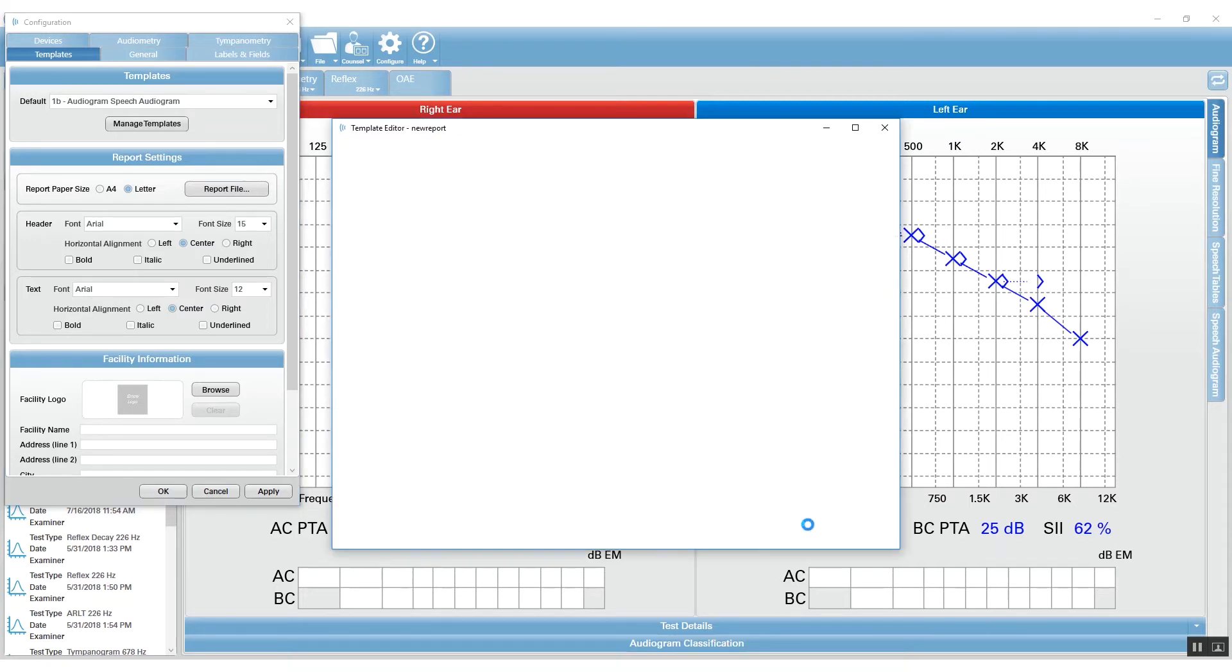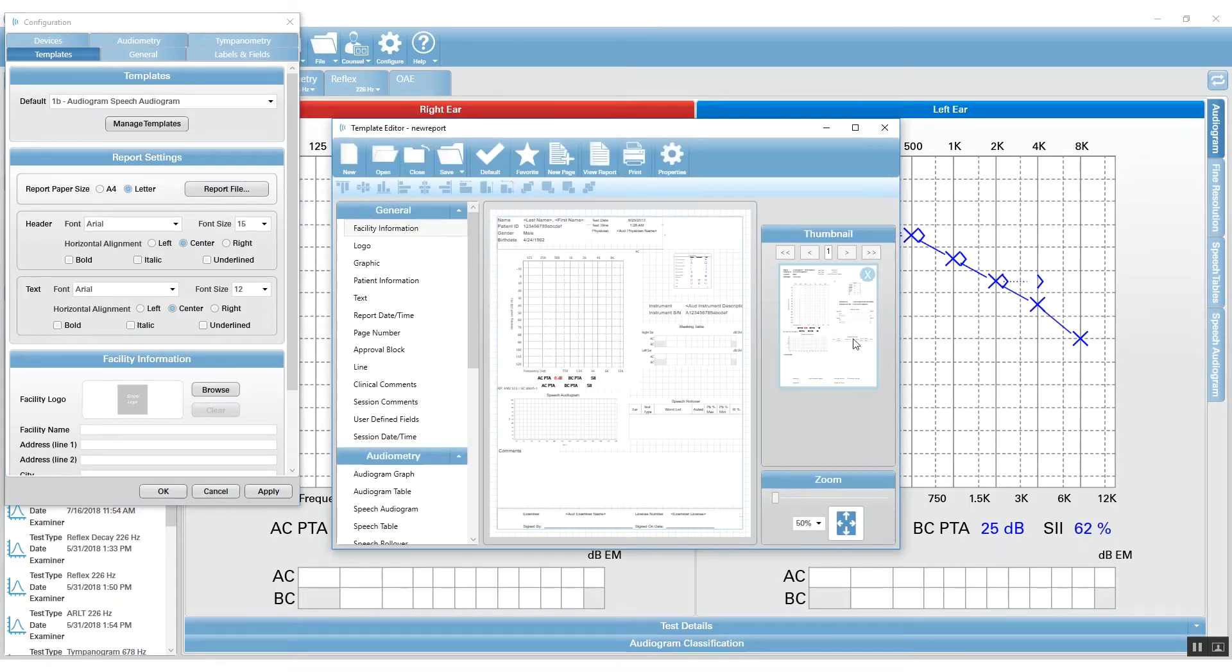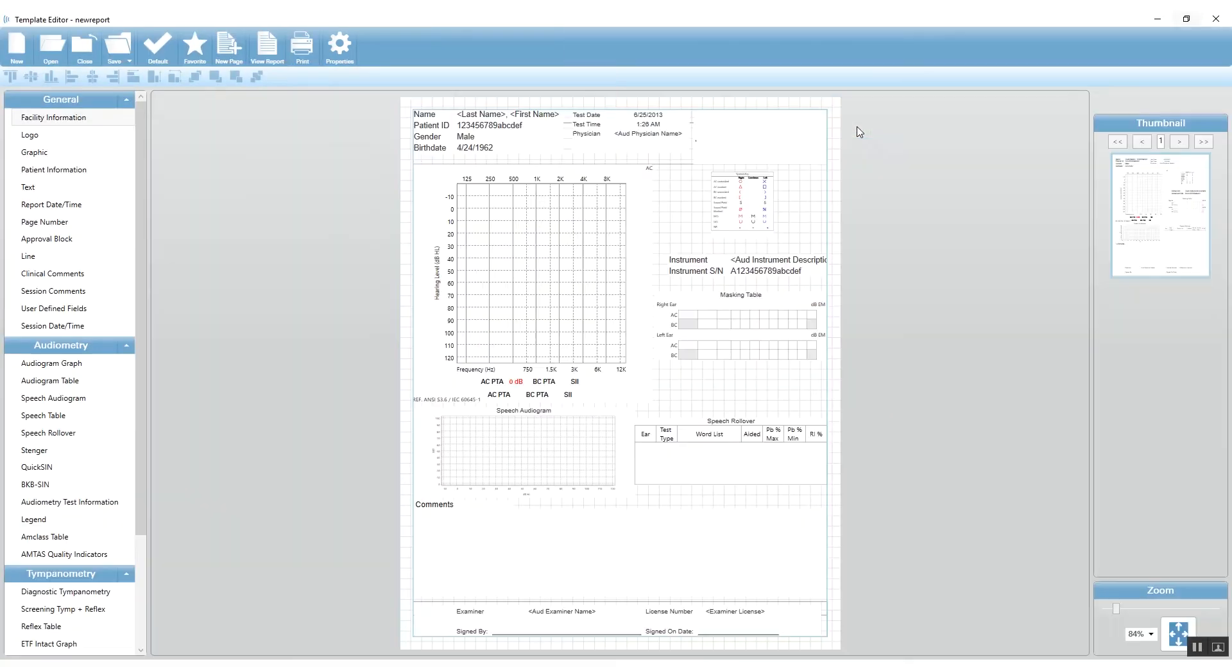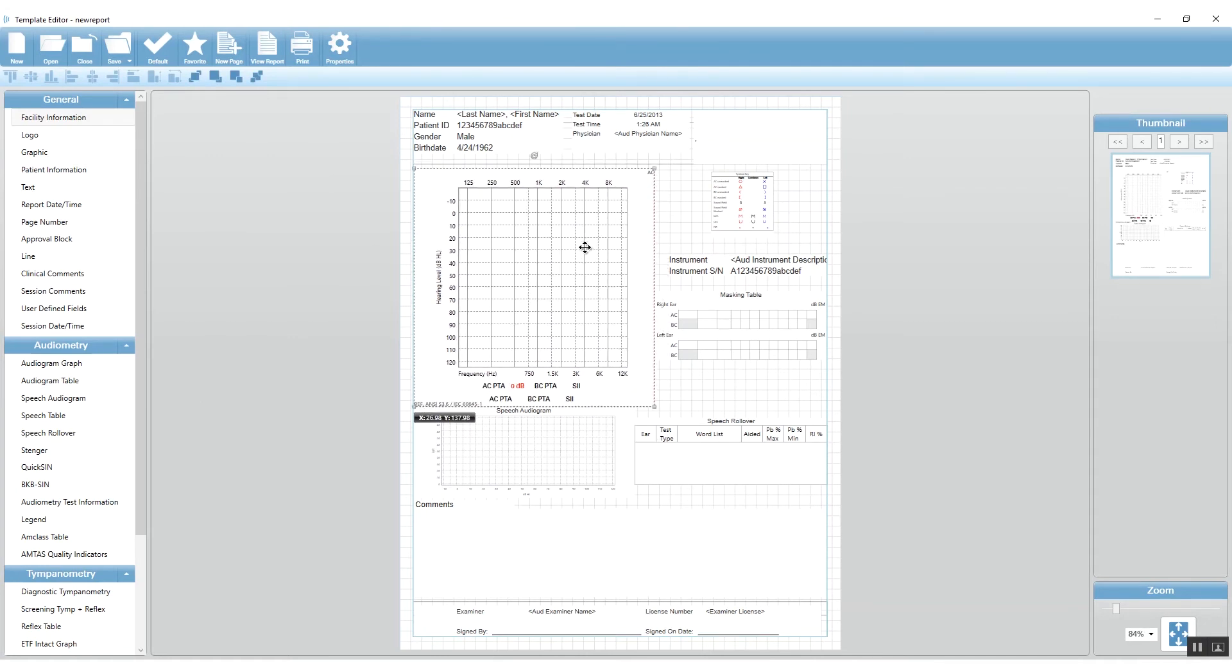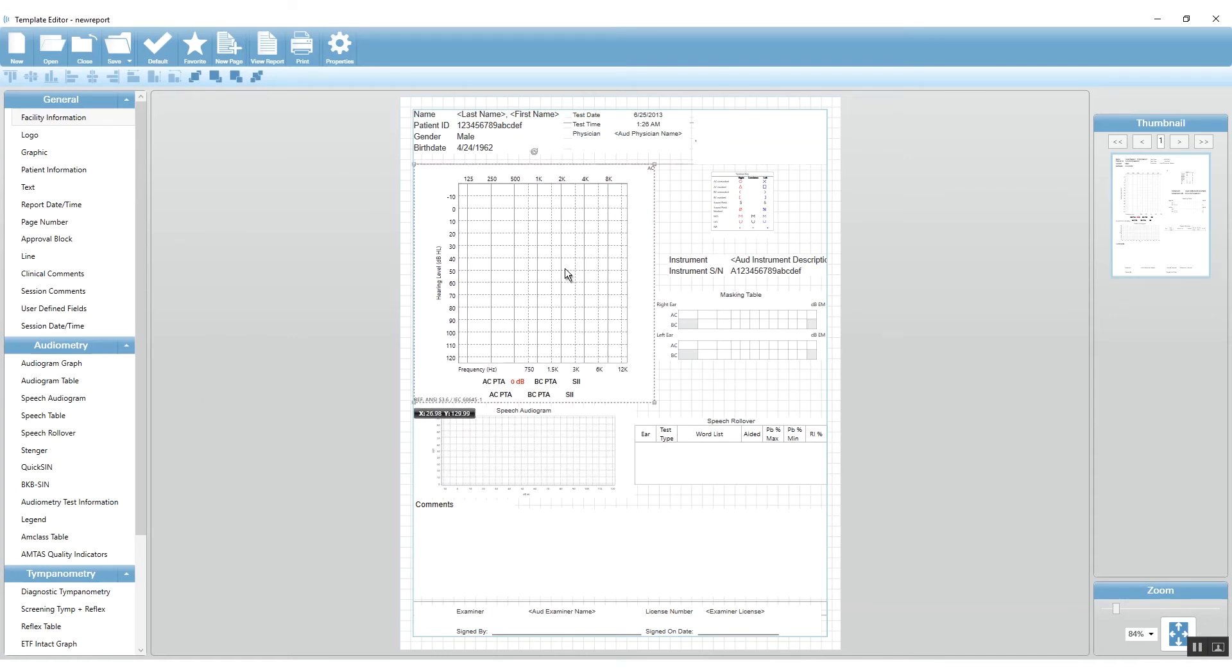From here, you can make changes on the components and drag them around. There's a webinar called Get Creative with Suite that will help you navigate through this entire Template Editor.